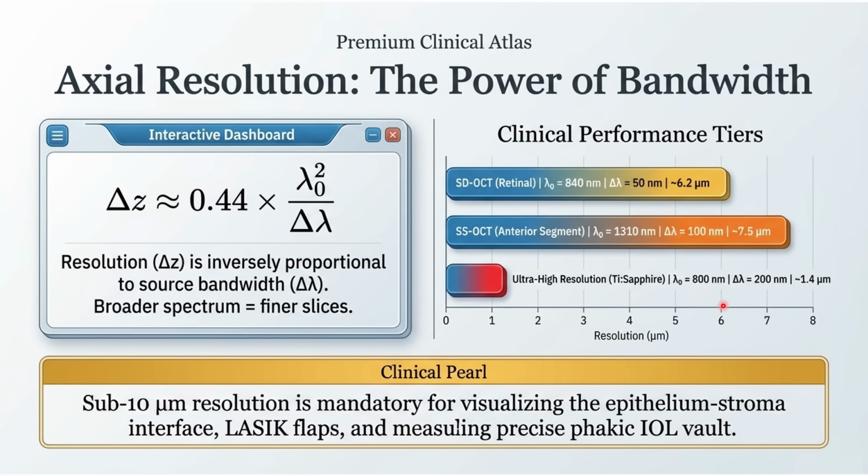Now let's explain why this happens. The wavelength is a function of the penetration. In the swept source OCT, we need to have very good penetration of the opaque structures, as I said before, like the sclera and the iris, to have more fine details. So at that time, we increase the wavelength. But this increase in the wavelength has brought the resolution to a bigger figure, so that the resolution becomes poorer here. But we have to sacrifice some degree of resolution for the sake of increasing the penetration.